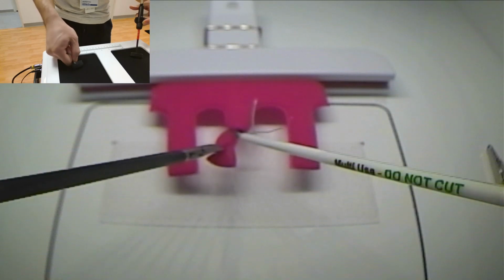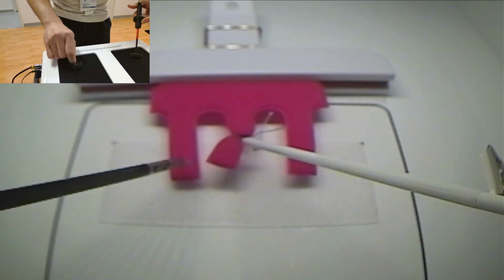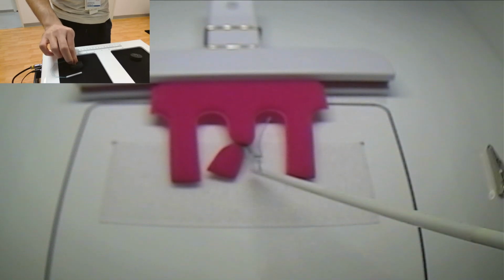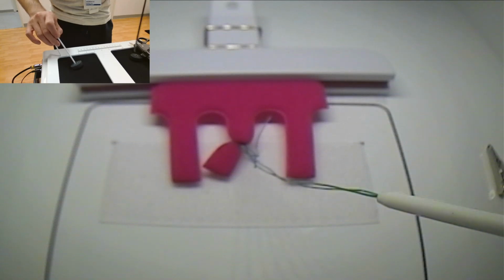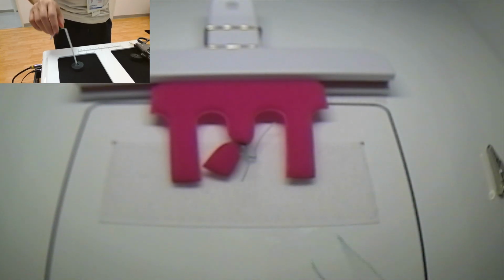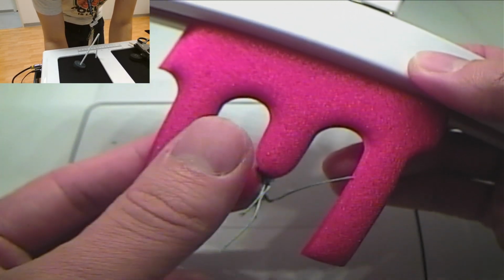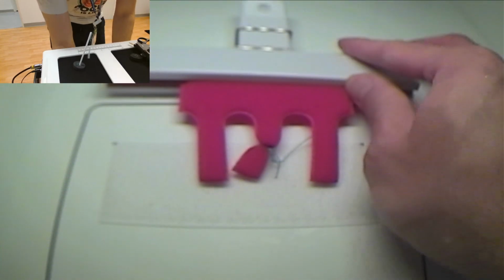Once it's cinched down, you can confirm that it's nice and firmly on there. Then you can pull back, and then you just need to cut it over here, and then you should be done with the exercise. It needs to be within 1 millimeter of the black line, but it looks like it's on there. So that's loop ligation for you.